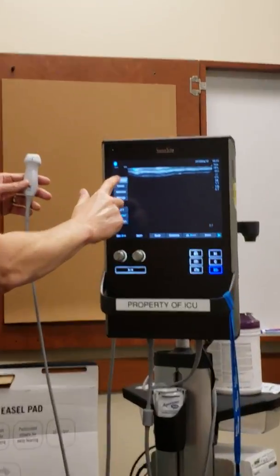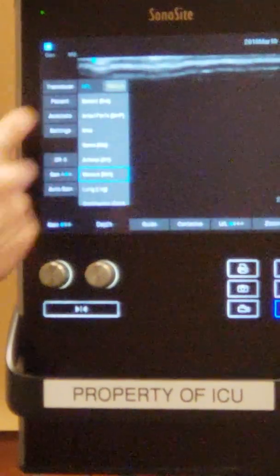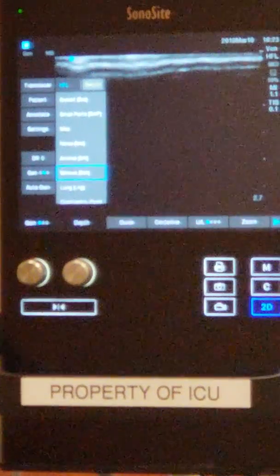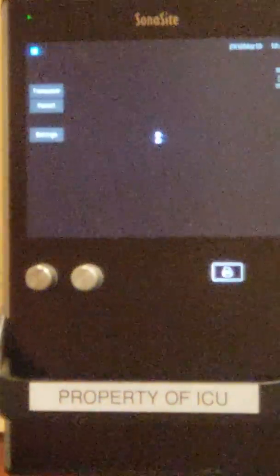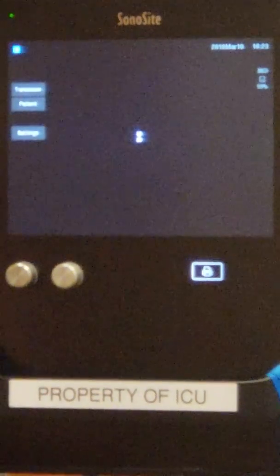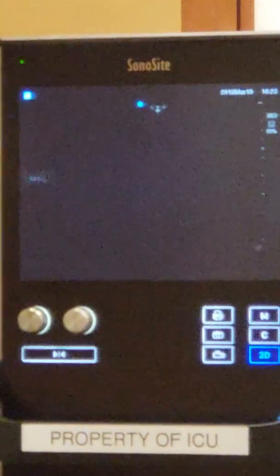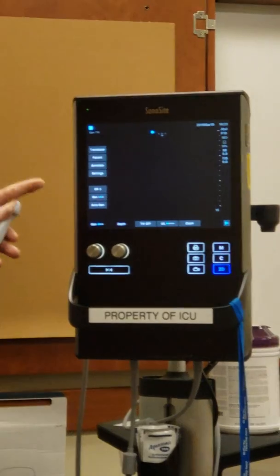To change the probe, we go to 'Transducer,' then click 'Switch,' and it'll switch to this probe. It takes a second.